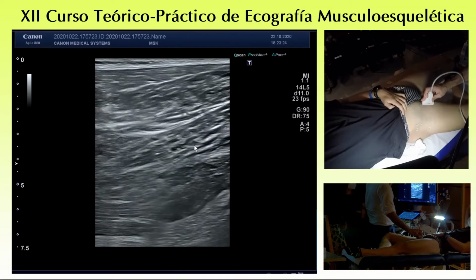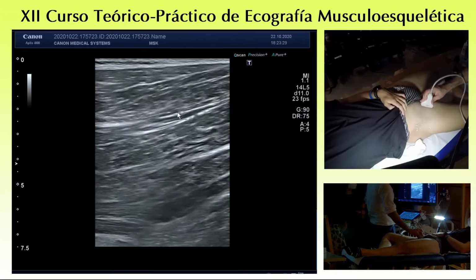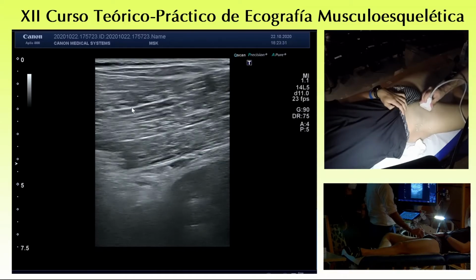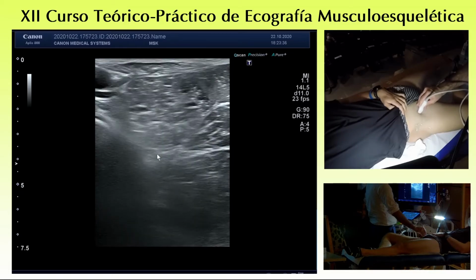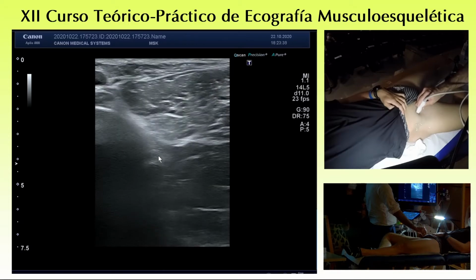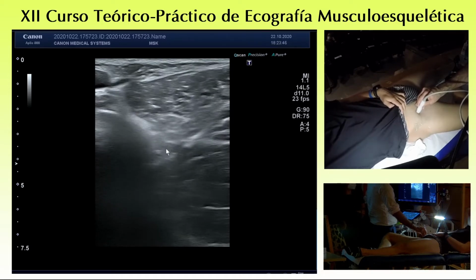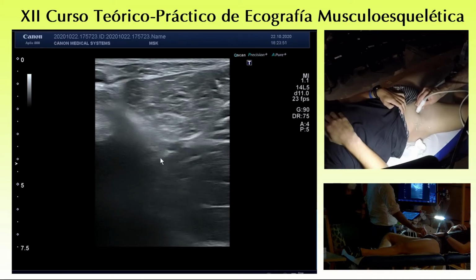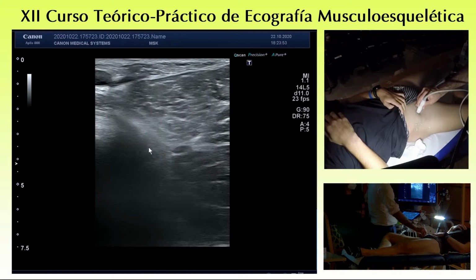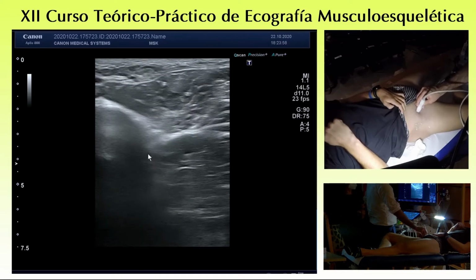Indeed, at this level it's not very useful to look for these branches, because the area of pathology, as I told you during the presentation, is usually very proximal, where there is also the obturator artery. This is where you have all the causes I told you before: maybe bone alteration, bone fracture, or obturator hernia. This is the spot where there is more possibility to find pathology.